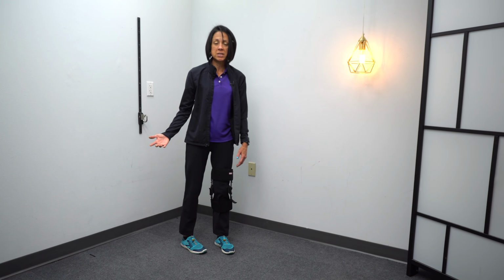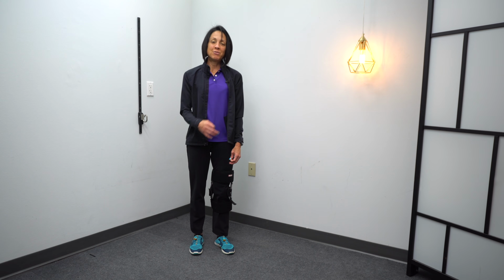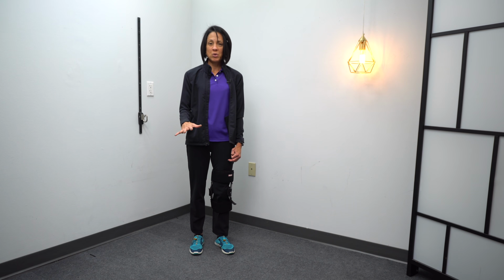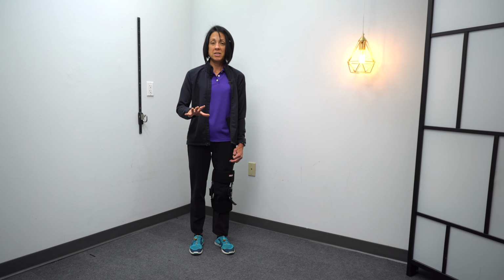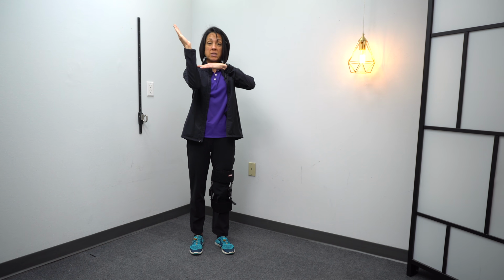Of course, the best thing to do is to have an AFO with a plantar flexion stop, which I've talked a lot about in a ton of videos. For those of you that are new, I'm not going to go in-depth, but it's basically just an ankle brace. What a plantar flexion stop on an AFO does is it doesn't let the brace point, and they can set that to any number of degrees, usually like 10 degrees of dorsiflexion.